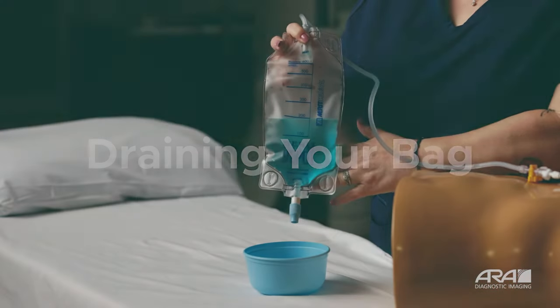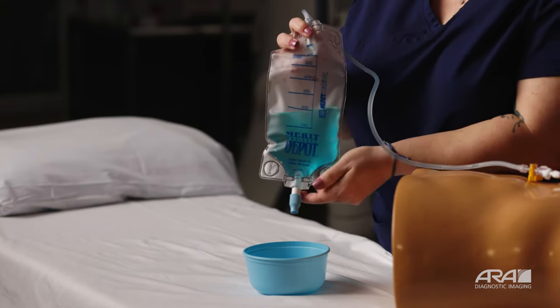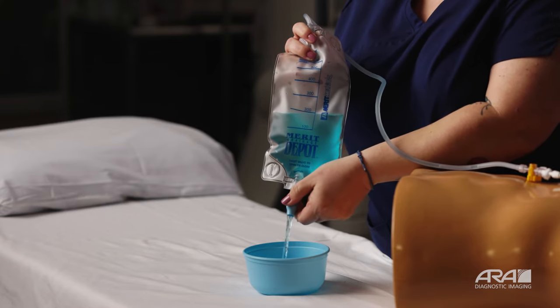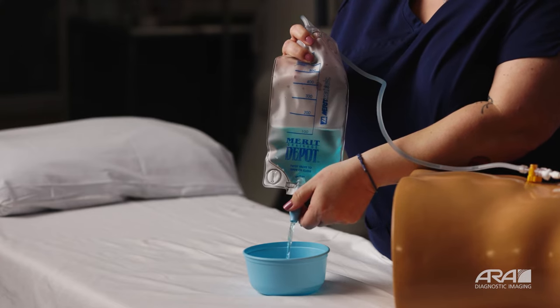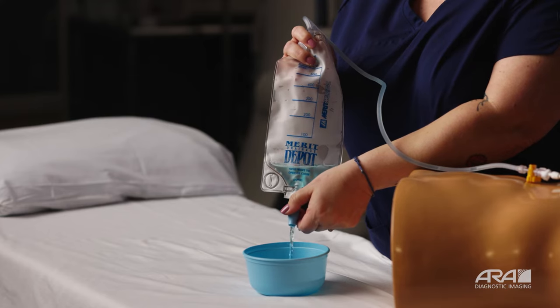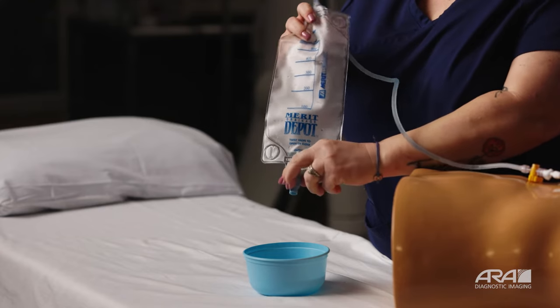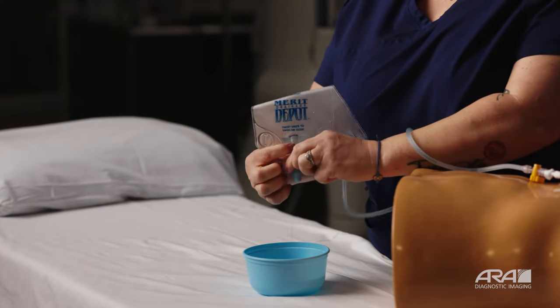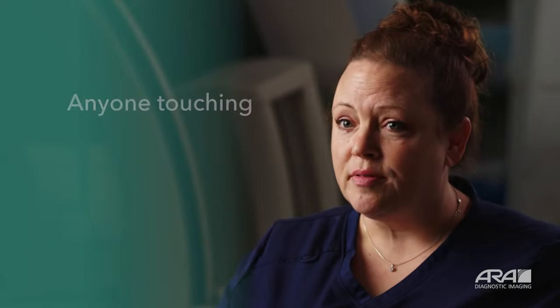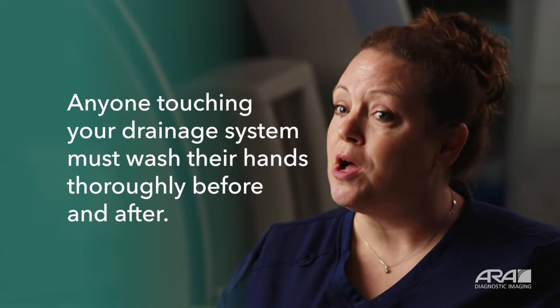After you've recorded your output for the day, you'll want to empty your bag. Go to the bottom of the bag and twist your blue cap until fluid is draining. You can drain this fluid into a bowl or into your toilet. Once your bag is completely empty, twist your blue cap in the opposite direction, which closes your bag. Remember, before and after emptying your drainage system, make sure and wash your hands thoroughly.